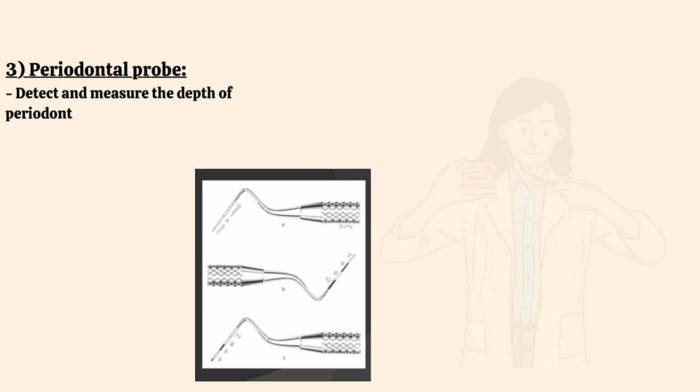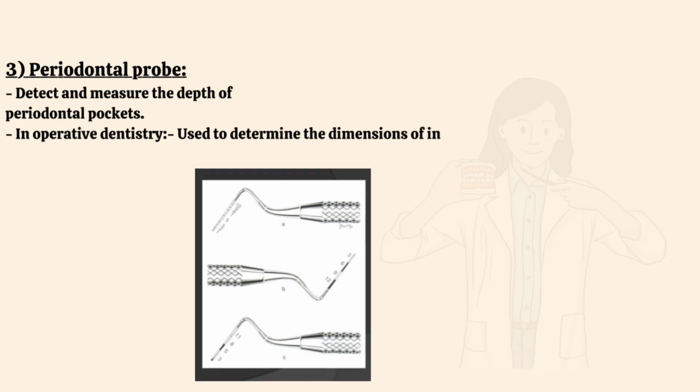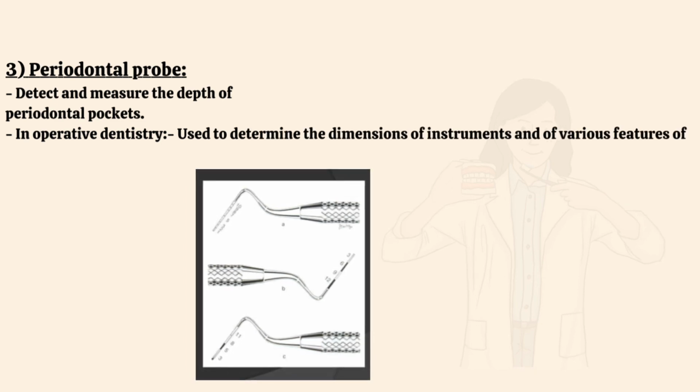3. Periodontal probe. Detect and measure the depth of periodontal pockets. In operative dentistry, used to determine the dimensions of instruments and of various features of preparations or restorations.